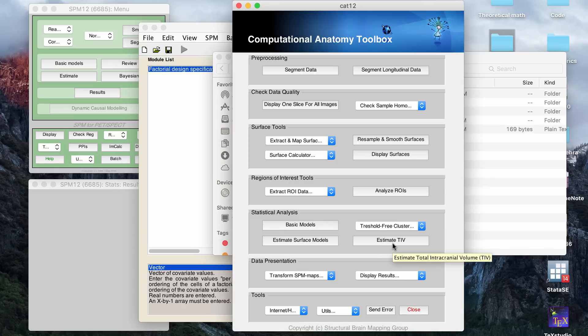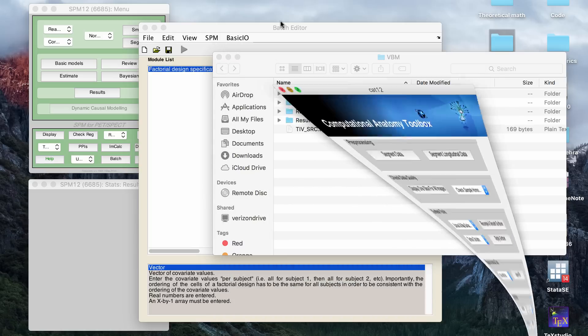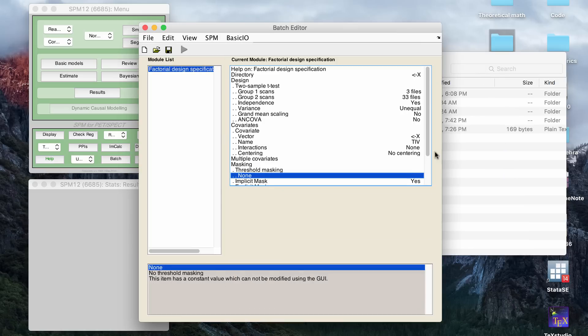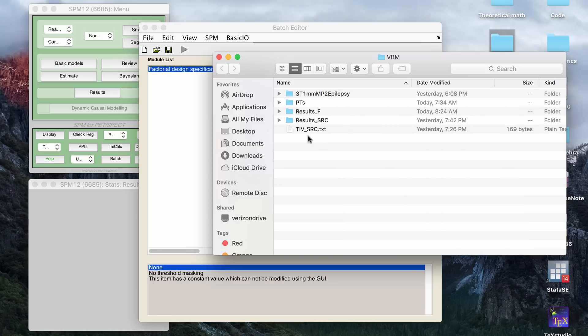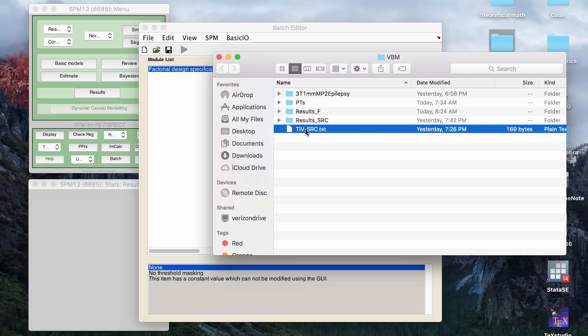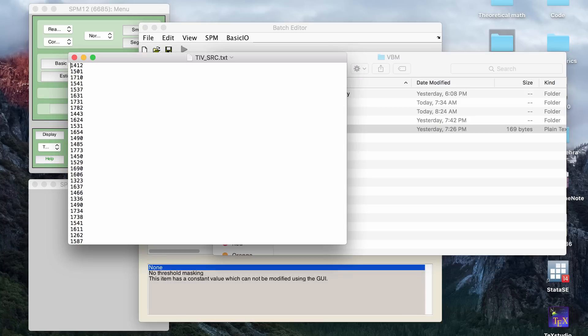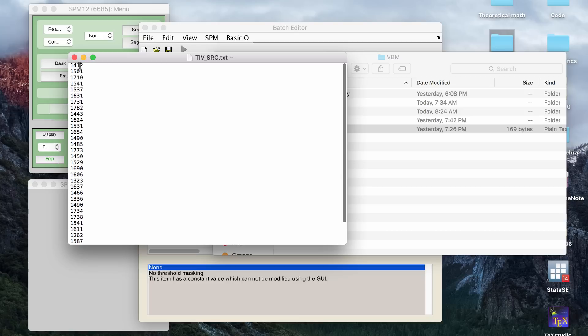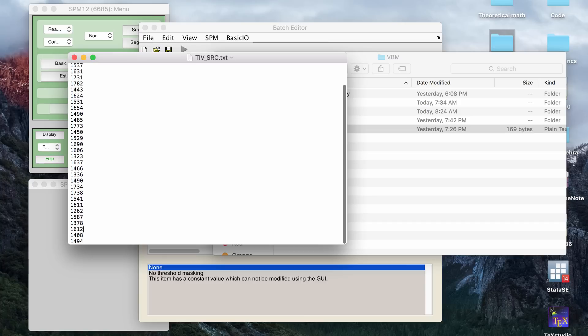Again, for me, I don't know if I was just doing something wrong, but it didn't work when I tried to use the button. So I had to do it manually. What I do is I manually created a text file. So if I open that here, you see I have a text file full of numbers. And the way I do it is that this number, the first line I have is for my one patient. And then these are all an ordered list of the TIV I have for controls.